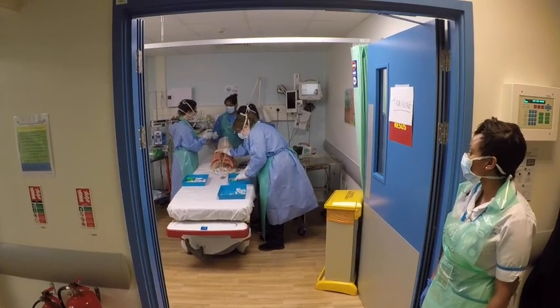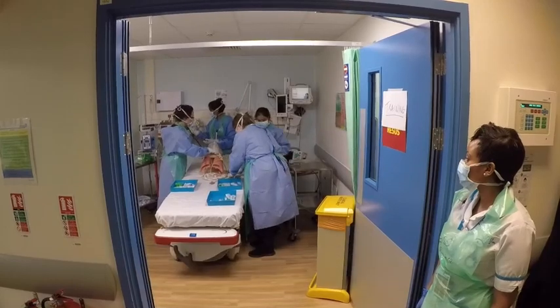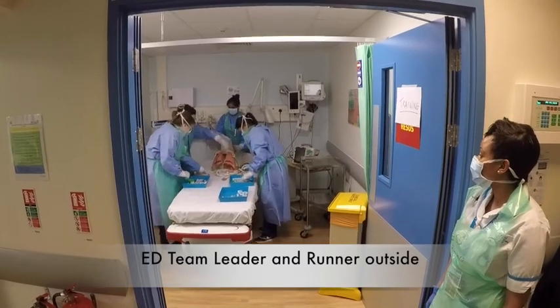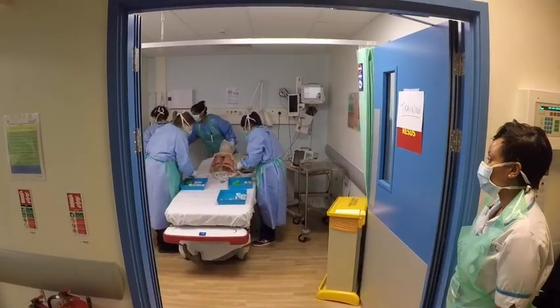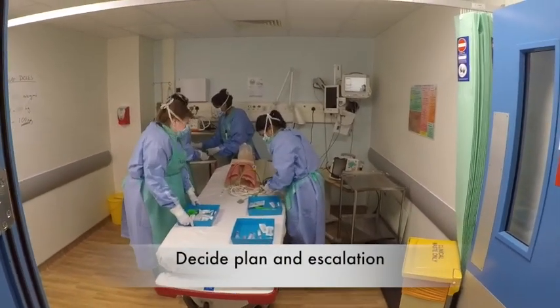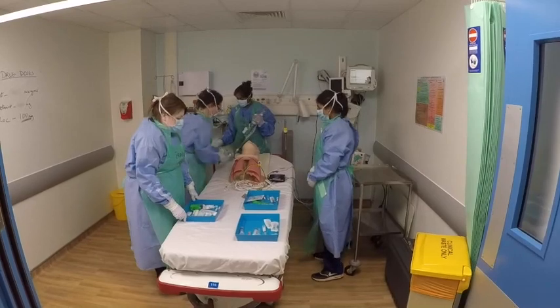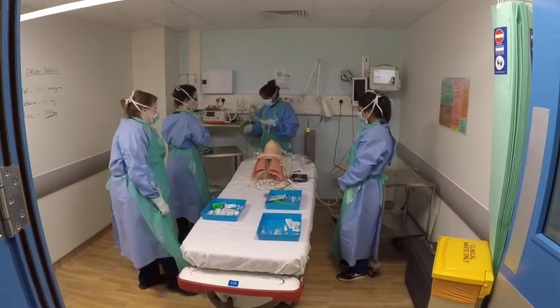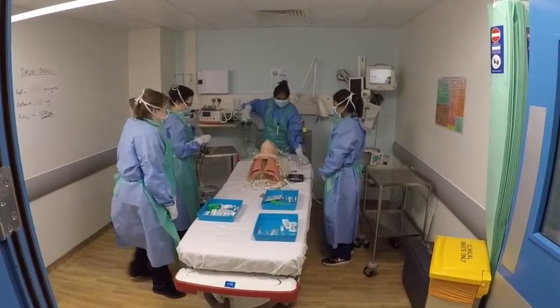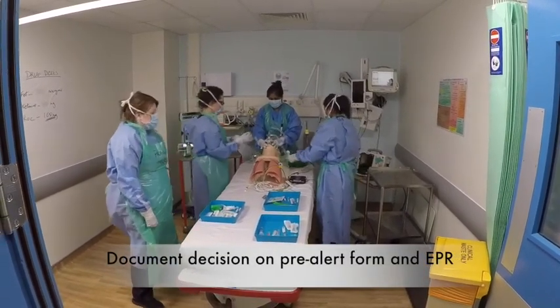Whilst the team are undergoing their assessment — getting monitoring on, gaining IV access, and doing what we routinely do — the ED senior is outside the room in the clean area along with the assistant runner in flu PPE. At this point, a rapid decision needs to be made by the ED senior — whether registrar or consultant — as to whether this patient is for palliation and DNAR for ward-based care, or whether this patient is going straight to intensive care and requiring an aerosol generating procedure, i.e. intubation immediately whilst in our respiratory ED.